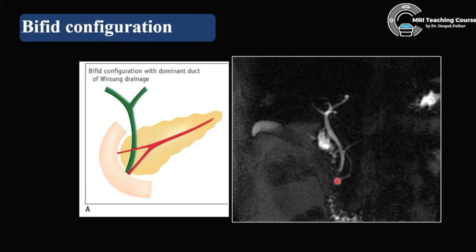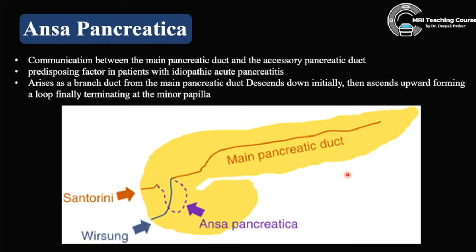This is the example of bifid configuration with dominant duct of Wirsung — the duct of Wirsung is dominant, and a minor duct is draining into the minor papilla. Always do your own reconstruction on the monitor rather than relying on images reconstructed by others. Then ansa pancreatica — this involves the minor papilla and is a communication between the main pancreatic duct and the accessory duct.